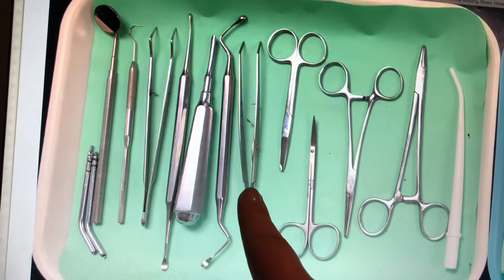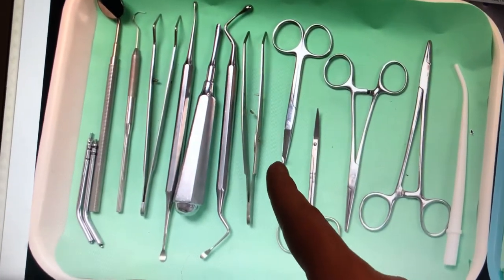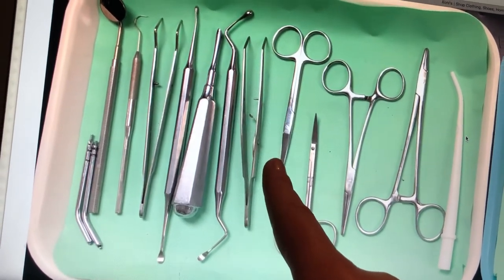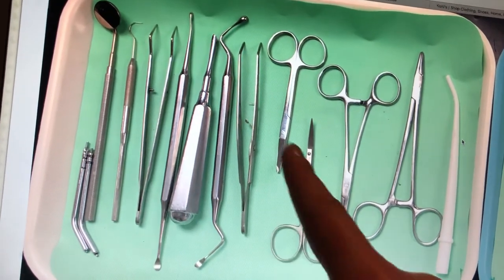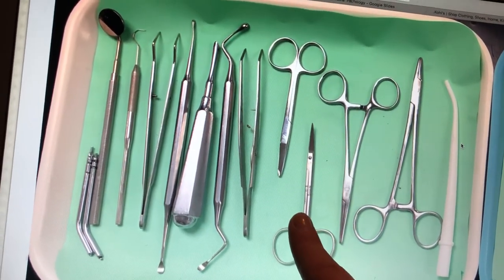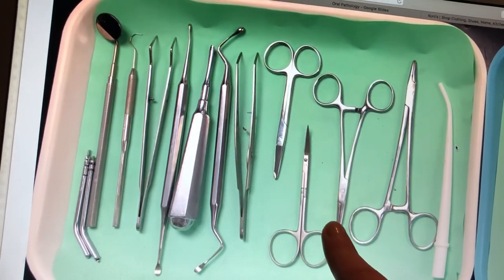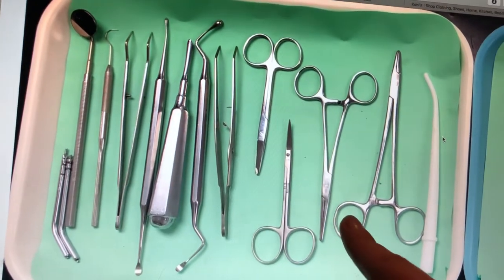We have more cotton forceps, and those are going to be used to retrieve instruments from the back counter or materials from in the mouth. Then we have suture scissors to cut the suture, tissue scissors to cut the tissues, and the hemostat, which is going to be used to grab tissues or bone fragments.